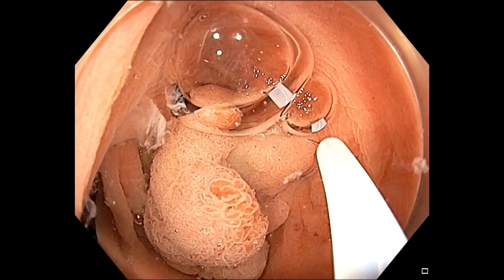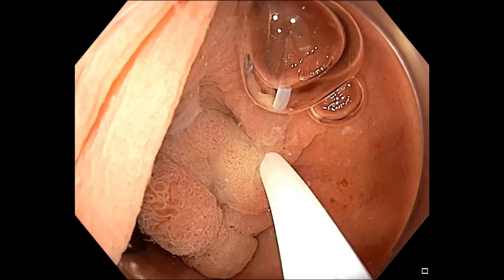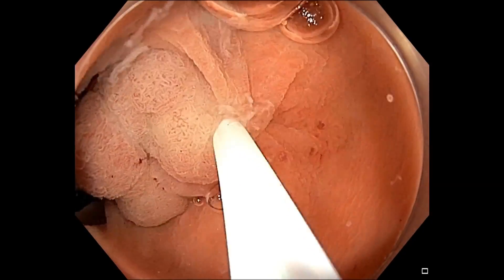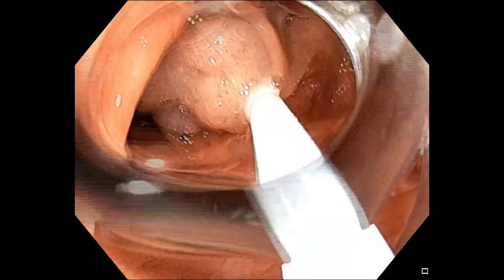The water acts like a zoom effect — you can clearly see the mark, the border of the lesion. It was in the right colon ascendance.